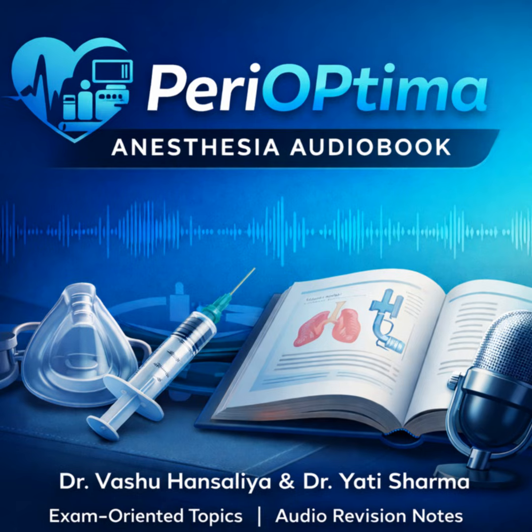The Tec 6 Plus requires electrical heating to 39 degrees Celsius to maintain a pressure of 2 atmospheres for its accurate vapor injection system. And the Desflurane limitation. The Tec 6 Plus lacks automatic compensation for high altitude. It requires the clinician to manually increase the dialed concentration to maintain the correct partial pressure. Monitoring versus prevention. Machine safety is preventative. Electronic monitoring like the O2 analyzer and oximetry is detective. Both are mandatory, but detection is the last line of defense after prevention has already failed.